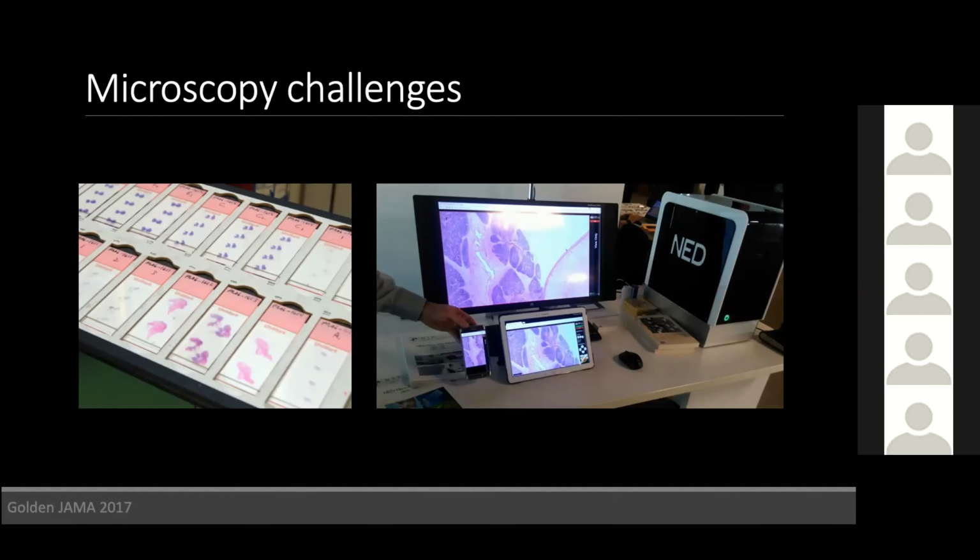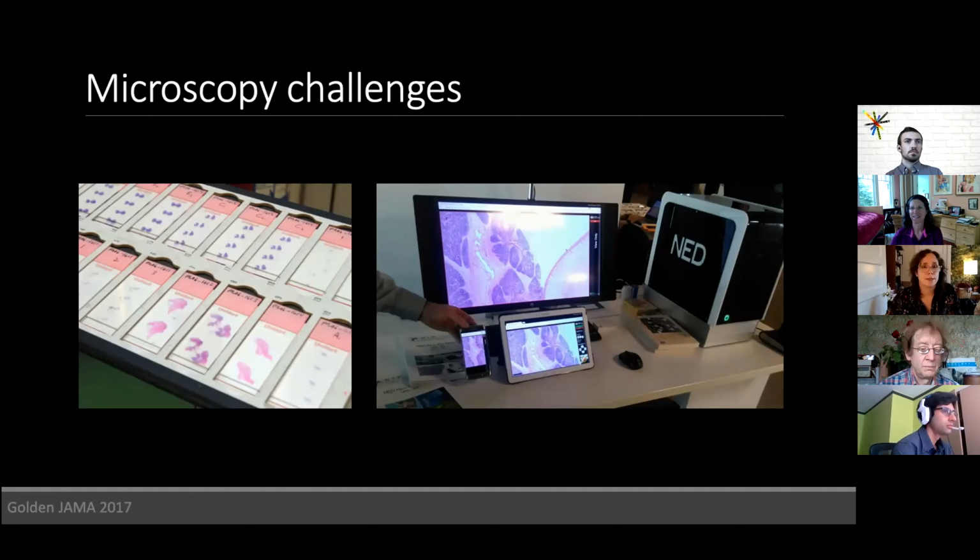So an experienced pathologist can very quickly scan a slide and find regions of interest for diagnostic purposes, but it takes quite a lot of training and lots of equipment. So there are solutions for digitizing this data, such as whole slide imaging, as well as ways to remotely operate microscopes. Nonetheless, these methods are significantly slower than having clinicians directly operate microscopes in person. And this actually also presents challenges for doctors to be able to keep up with caseloads, particularly in small hospitals where specialists might be in high demand, or for surgical cases where there's a lot of back and forth with the neurosurgical teams.